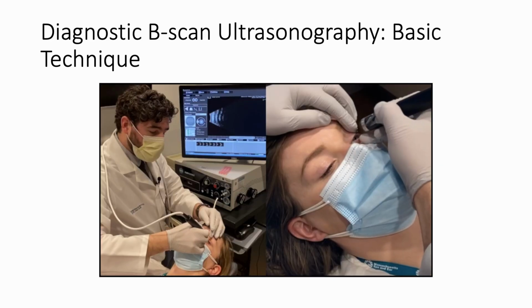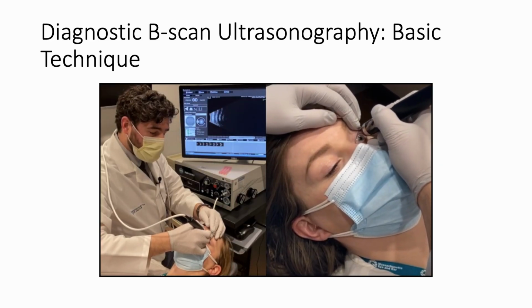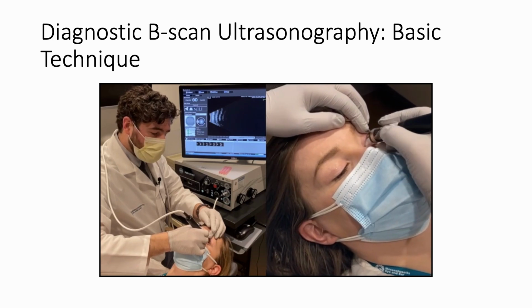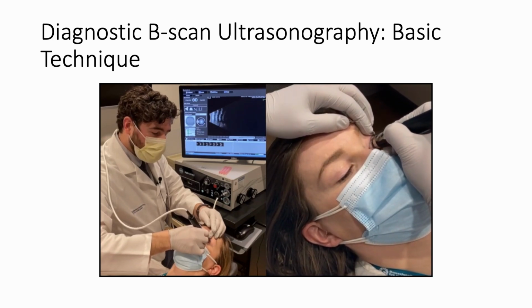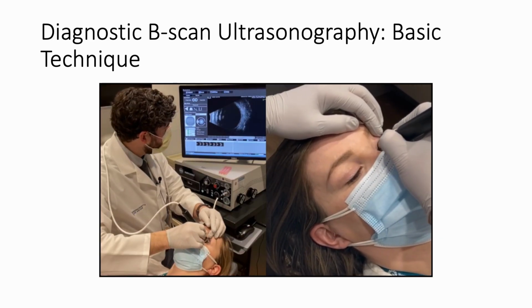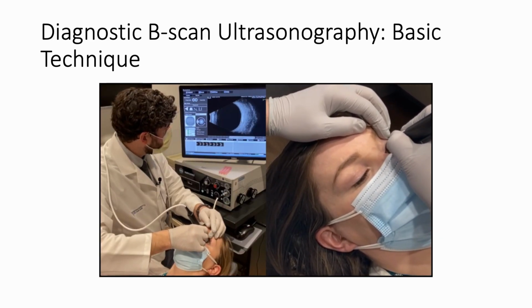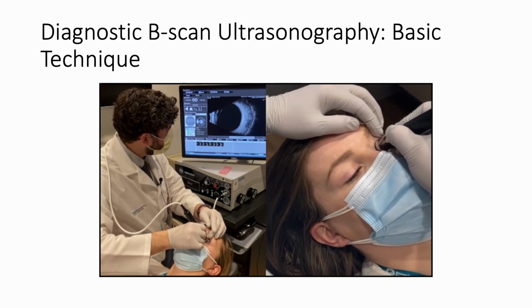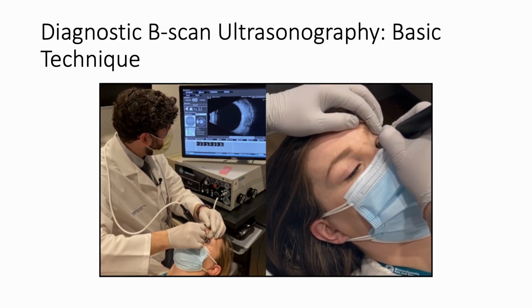Keeping your probe marker superior, we'll evaluate the temporal quadrant. Will be reversed, so we'll have you look to your left. In the limbal region now, sweeping temporally, anterior to posterior. Landmarking at the widest volume of the globe.